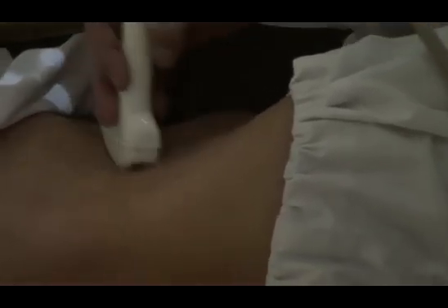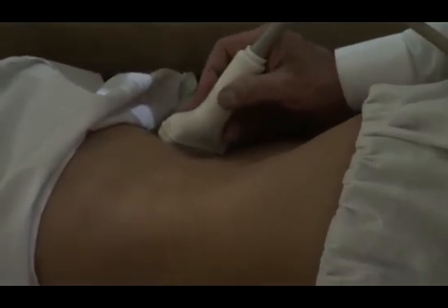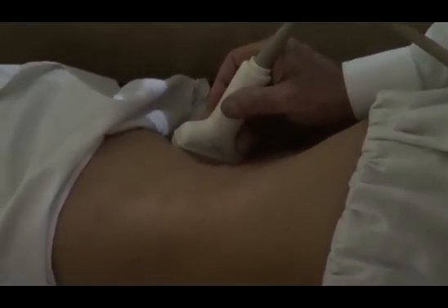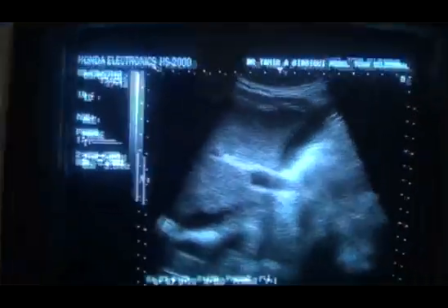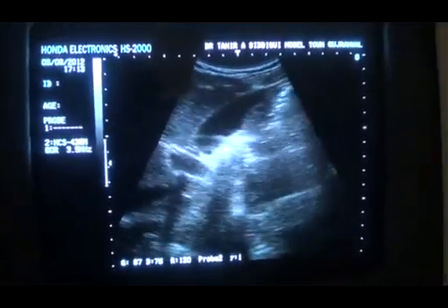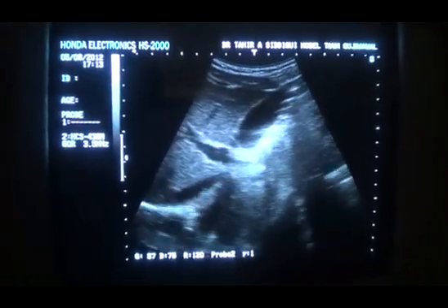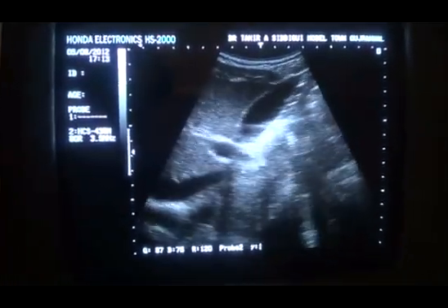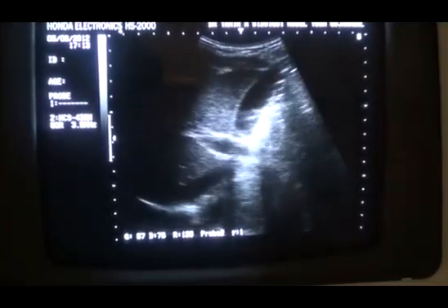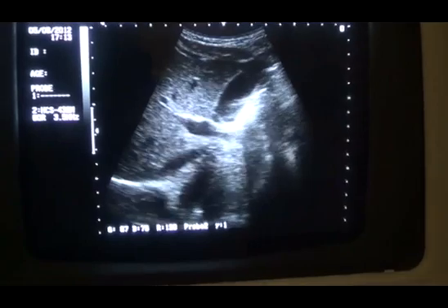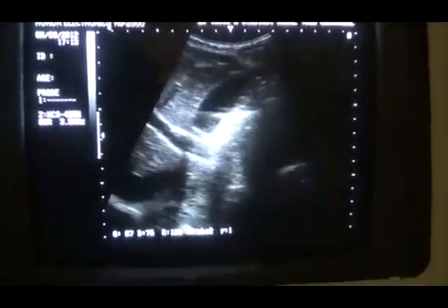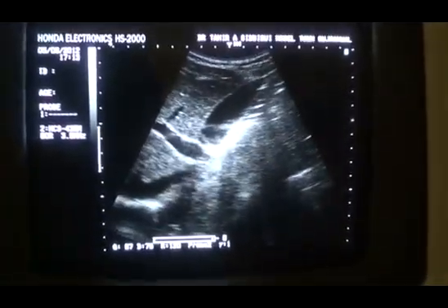This is what I was doing when the patient was supine — this is the subcostal area, this is the mid region. Place the probe perpendicular, angle it acutely towards the patient's left shoulder, and here we are. I am getting all of the gallbladder in total length, so I don't have to ask the patient to take a deep breath and hold it. This is the third way of scanning the gallbladder.